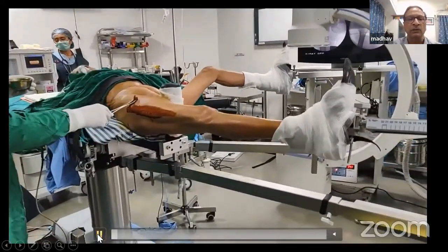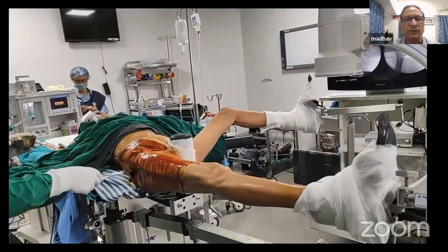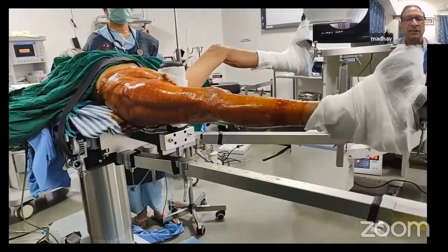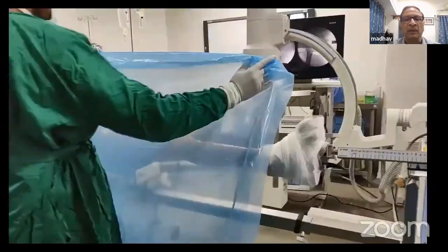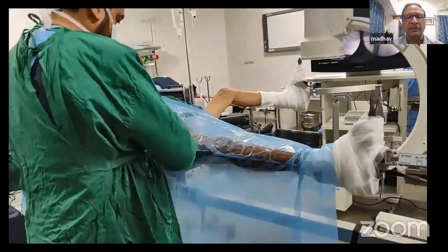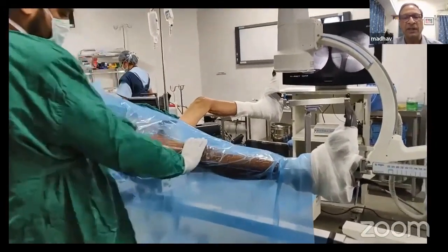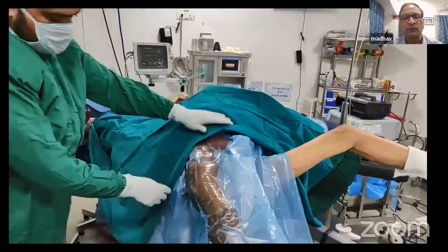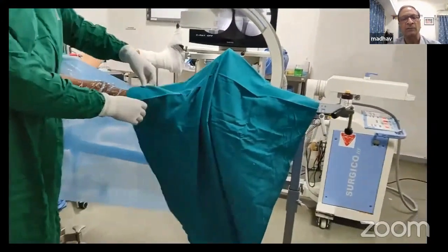Now this is the video. The patient is fixed to the fracture table, scrubbed and painted. First, you take a big plastic sheet and put it over the lower limb. Because of the betadine it will stick to the lower limb.